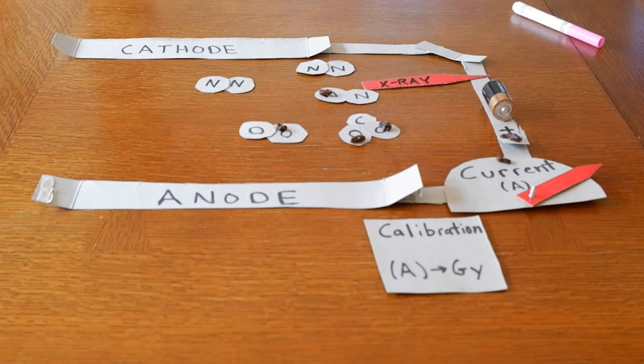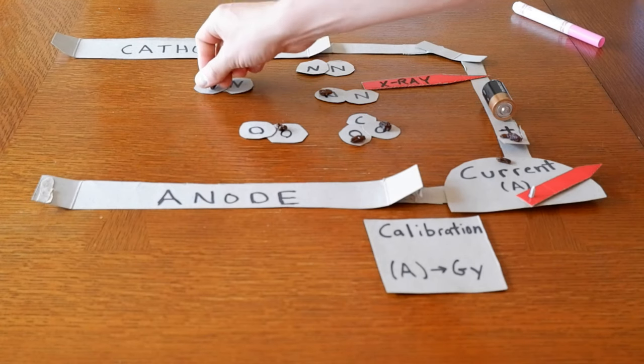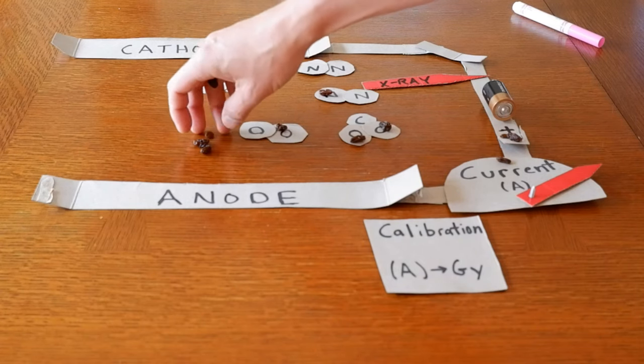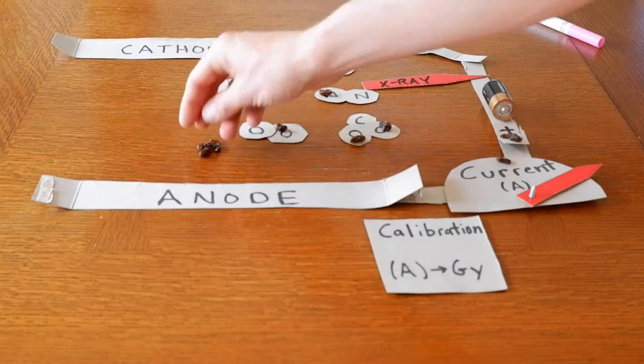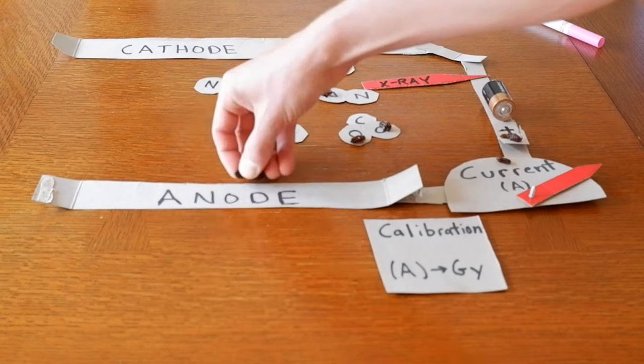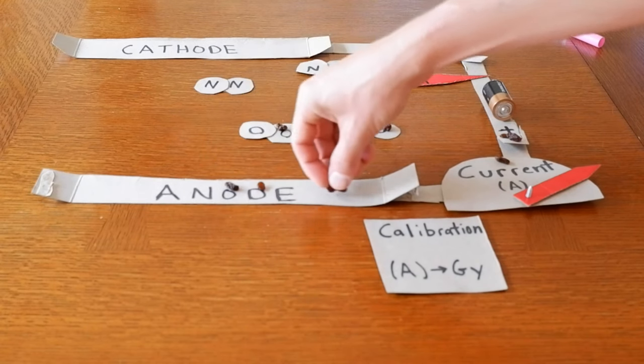In this case, if you had one electron coming through, that could lead to multiple electrons coming out of the gas.